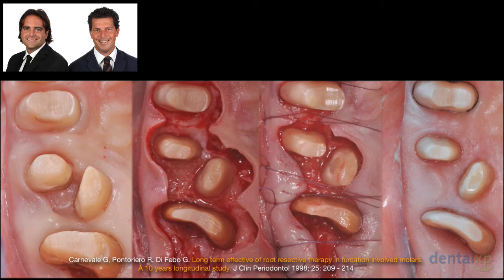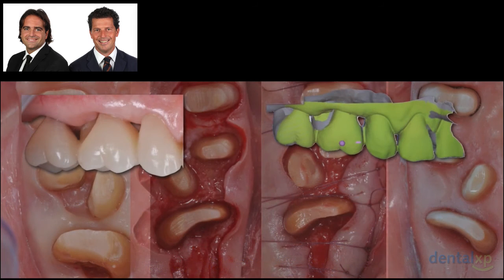And of course it's important to diagnose them correctly at the beginning, understand where to intervene, and of course carefully perform every single step of the procedure, especially starting from the temporary, because as I was telling you before, in the digital era a big part is done by the temporization, and this means that you have to spend time and speak with your dental technician and shape and smooth your provisional restoration correctly, because it can be very helpful.